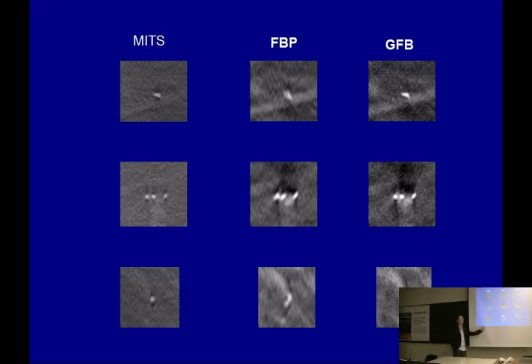Here we show some regions of interest, small areas cut from the entire image. Those objects are calcifications. Basically, they are small calcified dots inside the breast with a certain distribution. The shape of the calcifications may indicate malignant breast cancer or just benign tissue. This column shows the matrix reconstruction, the second column shows the filtered one, and the last one shows the combined one. The first one may have better high frequency components, like clearer edges, the second one may show some neighboring vessels, and we can combine them together to get a better reconstruction.